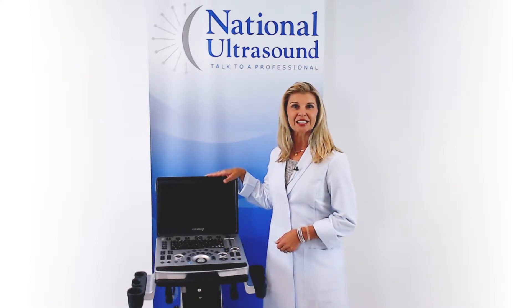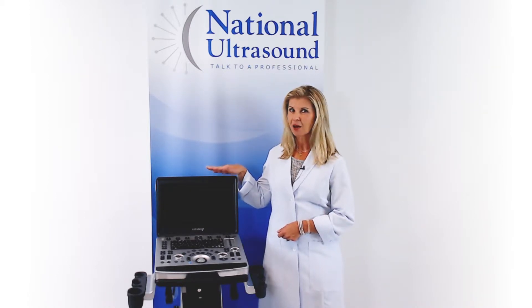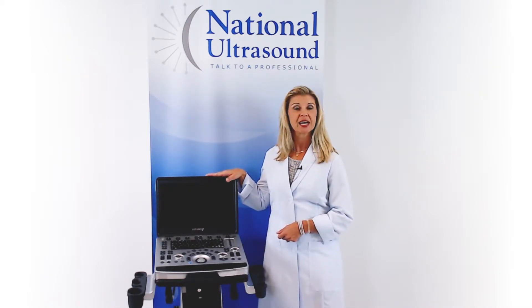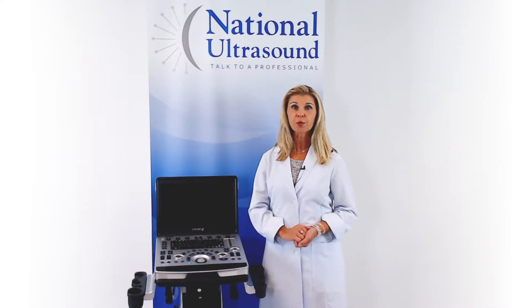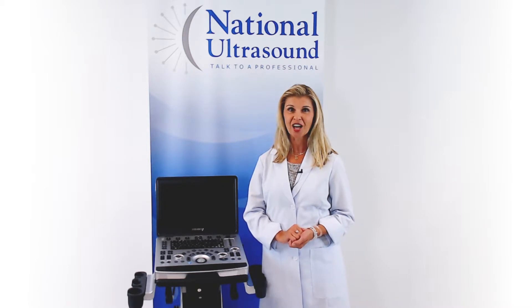The M8 Elite offers a fully featured platform with premium image quality. This compact, portable ultrasound machine delivers a powerful and reliable performance with advanced system processing and single crystal transducer technology.